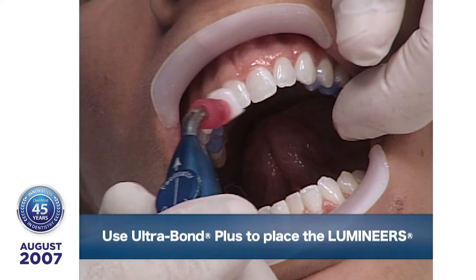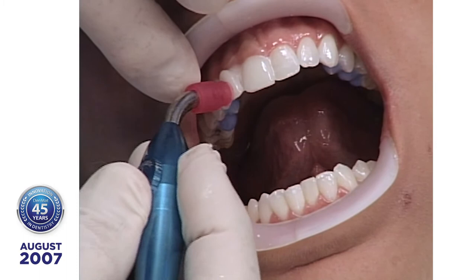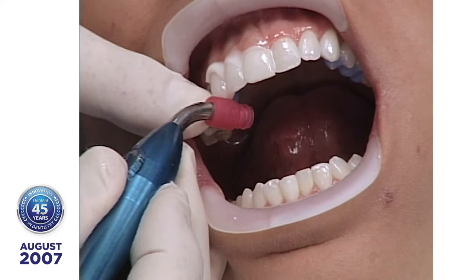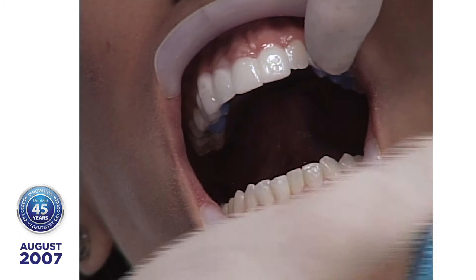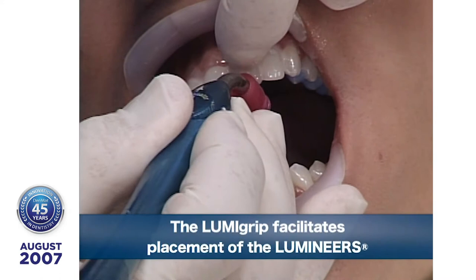This little device was developed by another dentist, Dr. Omer Meeker in Pasadena, California. It's called a LumiGrip — nice and flexible. You can see how easy it is to carry the lumineer to the tooth. I'll do the left lateral first, then the left central. I want to get that two-millimeter tip because the left central wants to fumble around just a little bit — I want to hold it in place. Close your eyes. I'm giving the two-millimeter tip a one-second spot cure.